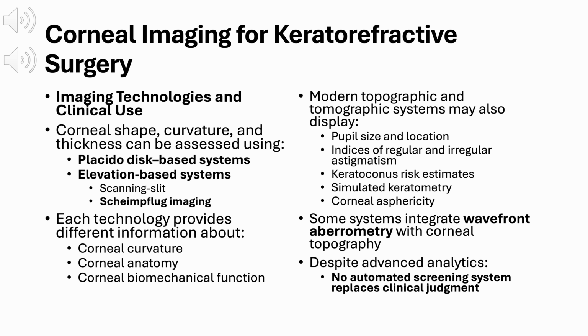Elevation-based systems include scanning slit technologies and Scheimpflug imaging, which allow us to assess both anterior and posterior corneal surfaces as well as corneal thickness. Because each technology measures the cornea differently, each one tells us something slightly different. Together, they give information about corneal curvature, corneal anatomy, and aspects of corneal biomechanical function.